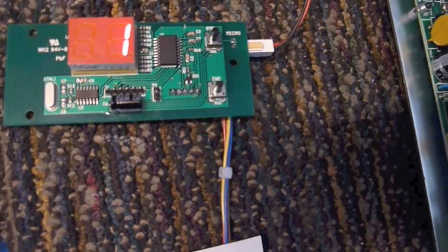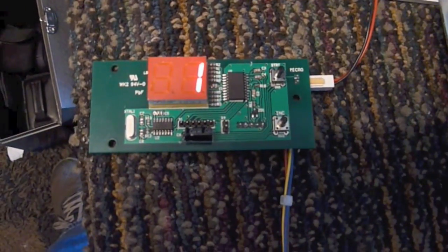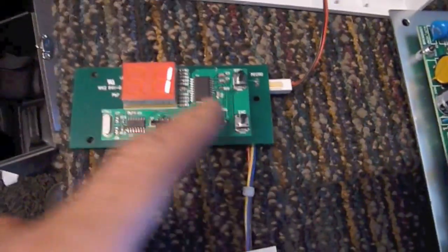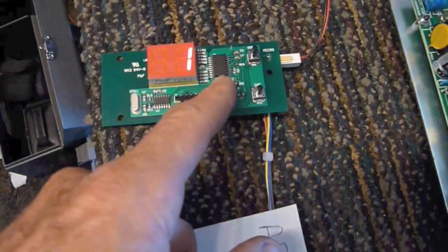Now, water can do a lot of damage and ruin things in a big way. But in this case, I thought maybe it'll be all right, because if I clean it up, that is, because it's a very low voltage circuit. I mean, this basically just provides a logic signal to turn on this motor over here. And so, I cleaned it up repeatedly.